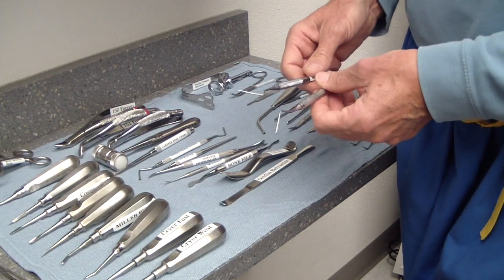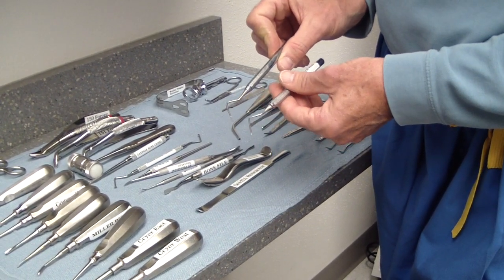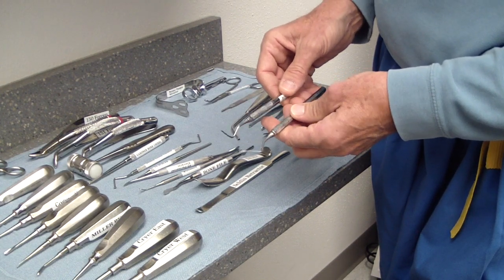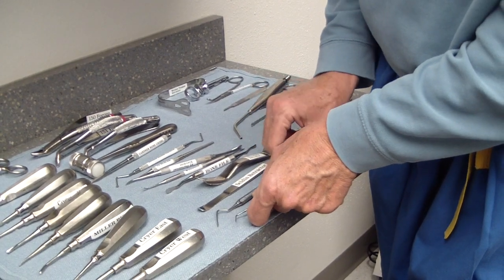These are the root tip picks. The name is self-explanatory — for small root tips down inside the socket. They're curved in opposite directions, giving you a right and a left. Very useful for retained root tips.